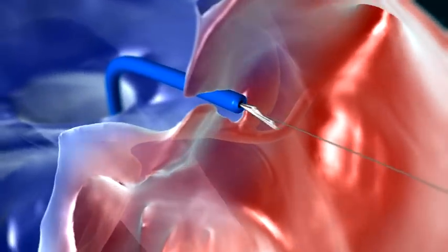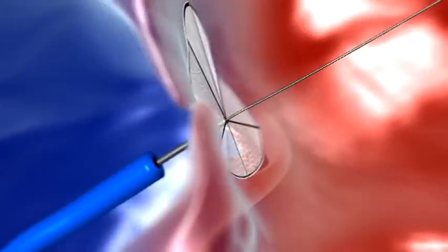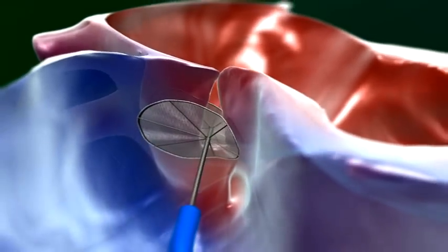The first envelope is unfurled. After this, the delivery catheter is retracted to unfurl the second envelope into the right atrium.